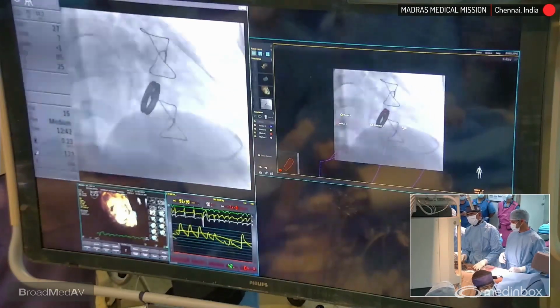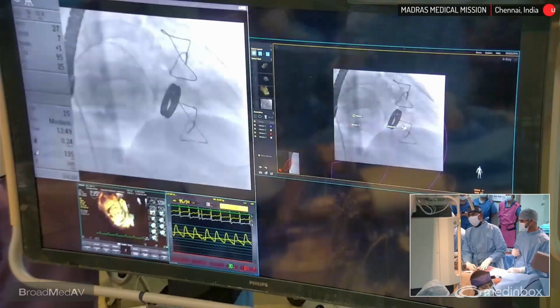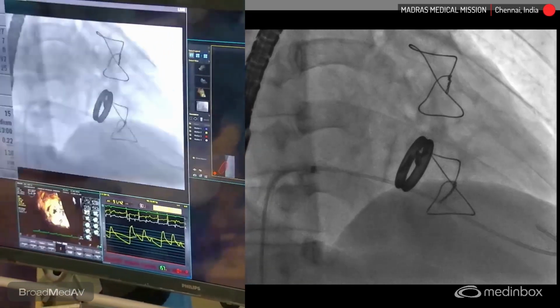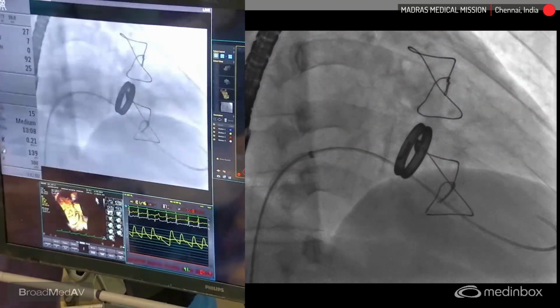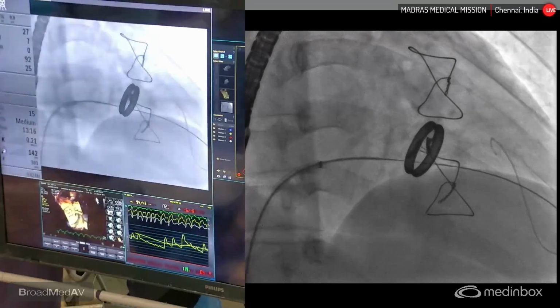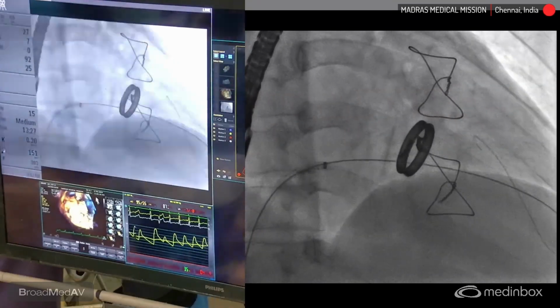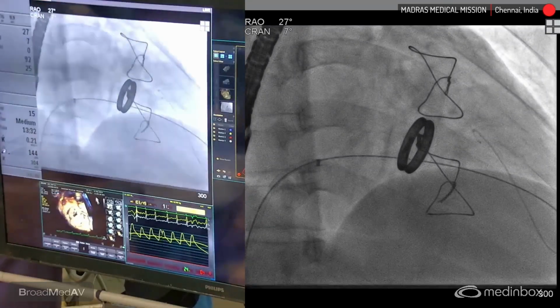It's getting tilted up. So what I will do is, I want more of the, okay. Okay. Now I am bringing it very low. Hold it. I'm again trying to advance the super stiff guide wire. And basically, now we are trying to reduce the curvature. Can we get it out? Feed the wire and get it out. Okay. So now again I will flush this system.